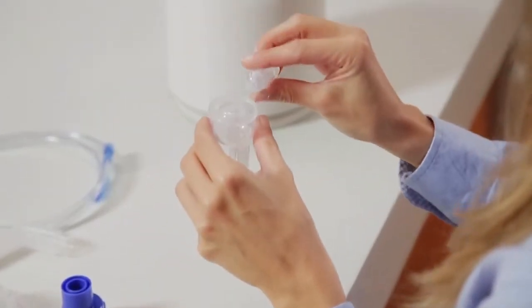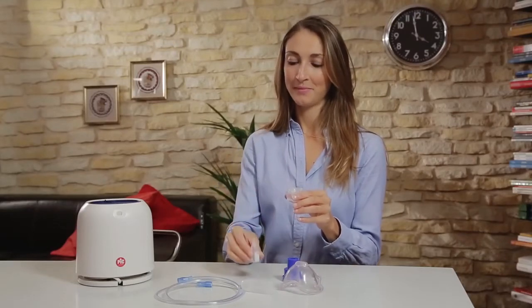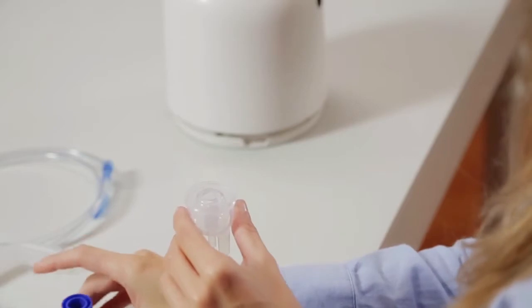Pour the prescribed dose of the medication or saline solution into the nebuliser cup. Securely close the cap and connect the tubing.